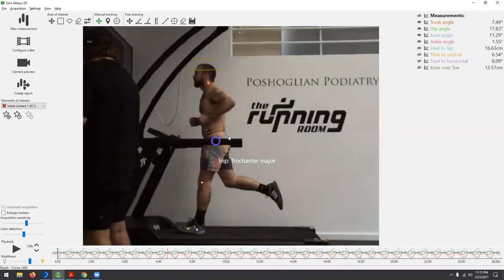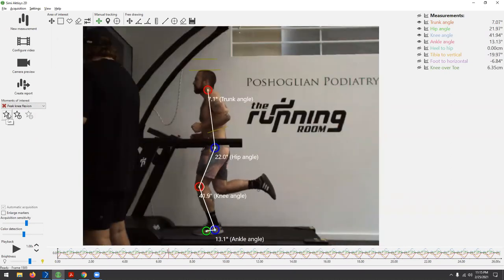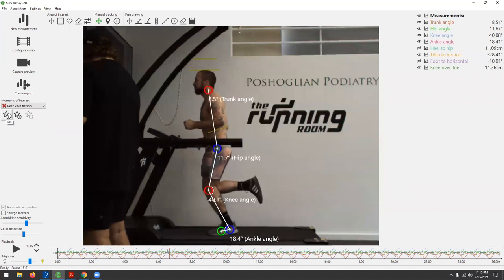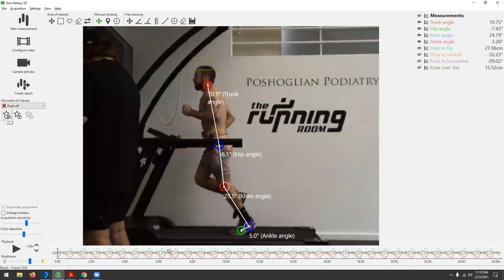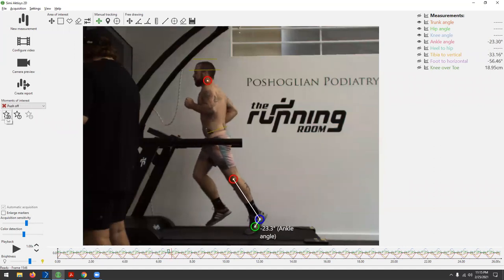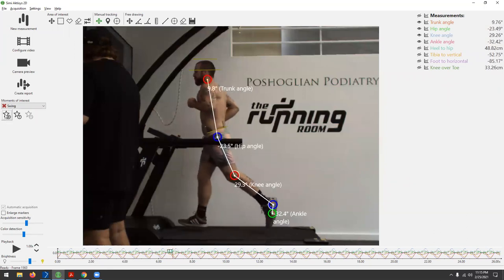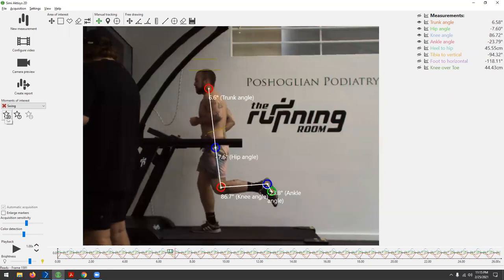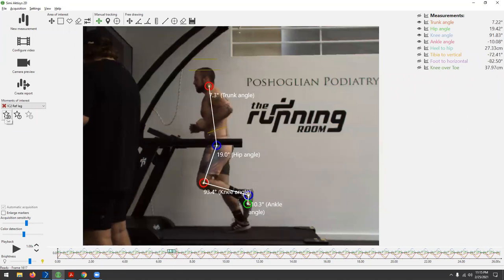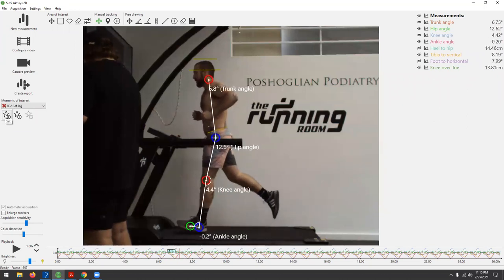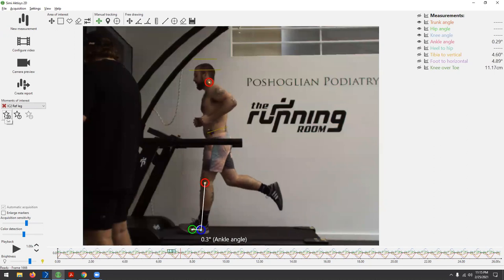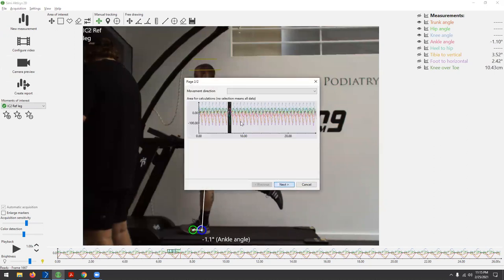I'm quickly generating a report while the runner gets used to this. I'm always asking how their symptoms are feeling — whether it makes them better or worse — which is often an interesting thing to ask.